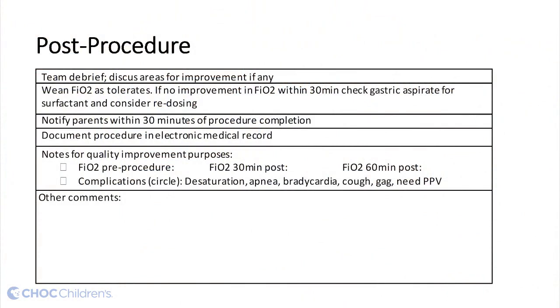Notify the parents within 30 minutes of the procedure completion. Document the procedure in the EMR. And lastly, take note of FiO2 pre-procedure, then 30 minutes after, and 60 minutes post-procedure, as well as any complications.